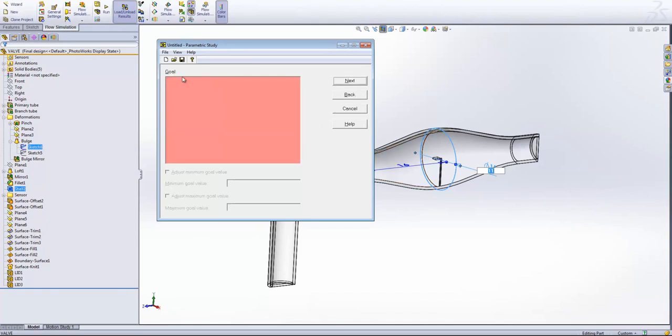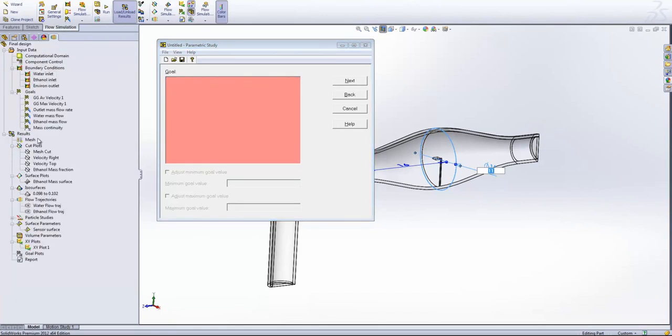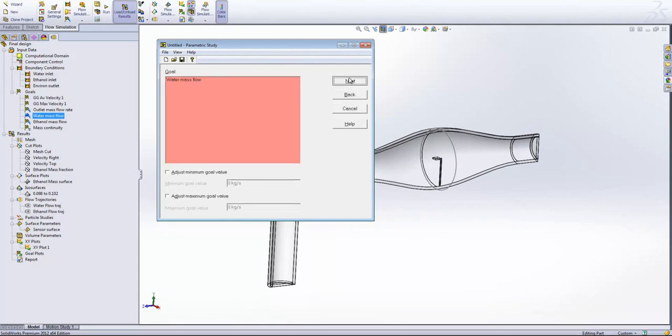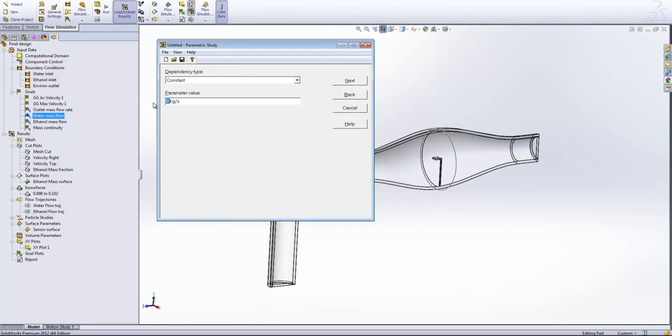And then hitting next, what we can do is grab a goal. So what I would then be doing is selecting the mass fraction, or the average mass fraction across the top of that surface. I haven't got a goal there this time, but we could simply add that by selecting it, and then specify what we want that value to be. So we could say we want that value to be 15 or whatever we're after, and then we can specify the convergence criteria. If we leave it as 0, it has to be exactly that, or we can say it can be plus or minus 0.01, etc.